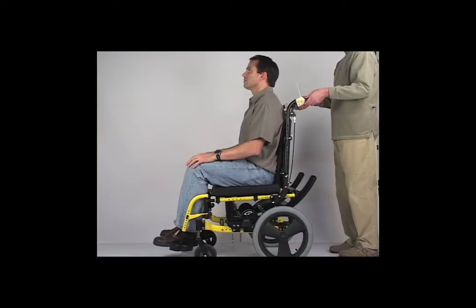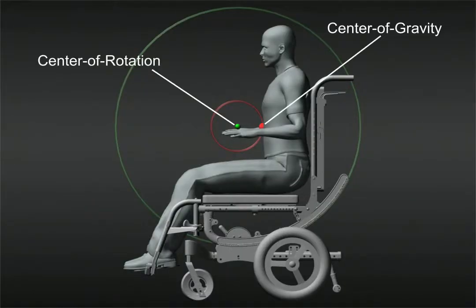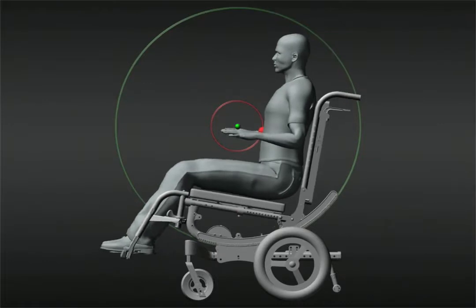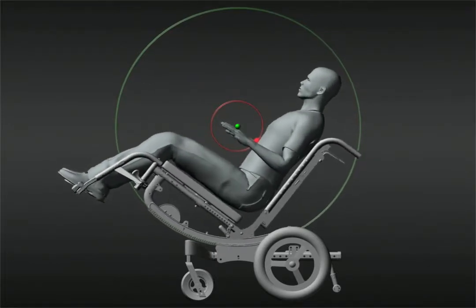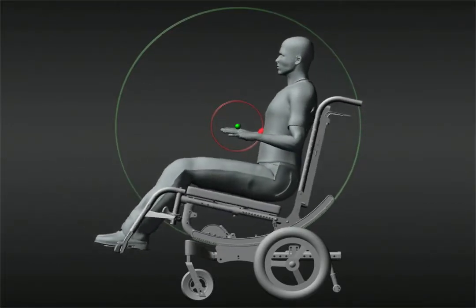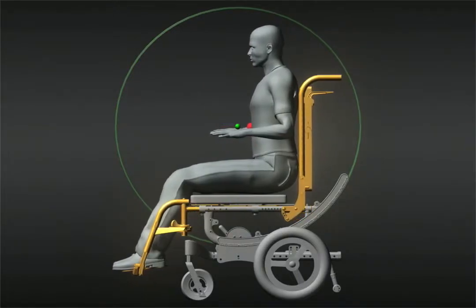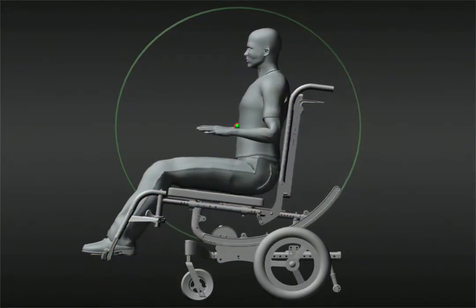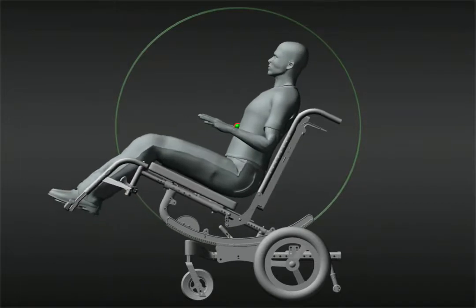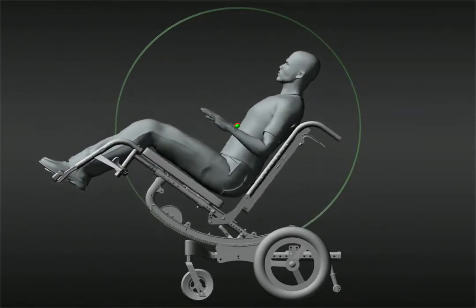Here we have an example of the center of gravity behind the center of rotation. As you've seen, this will cause the system to fall into a tilted position. But by moving the back canes and the legrest hanger assemblies an equal distance, you can change the relationship of CG and CR to bring them into alignment.